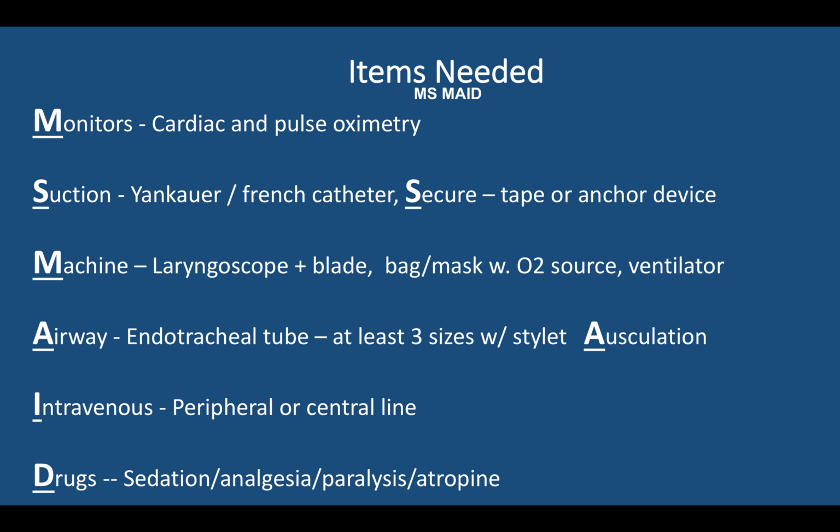Here is a visual of all the things that you need. Please note the monitor in the upper left, the ambu bag in the middle. Then next to it is the suction machine. There are variable types of suction, and you will decide which one you need at the time. You can see various types of securing devices also located next to an LMA. You'll also see different size endotracheal tubes, all with a stylet in it. Your end-tidal CO2 detection, tape, your baby, appropriate sized masks, blades, and so on.